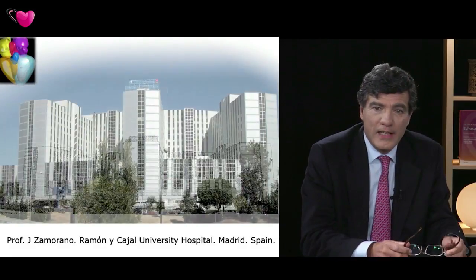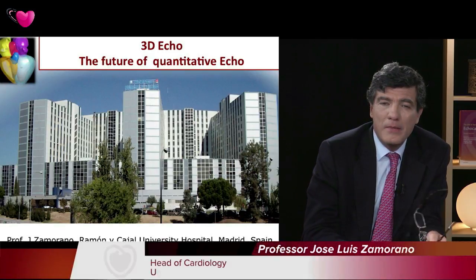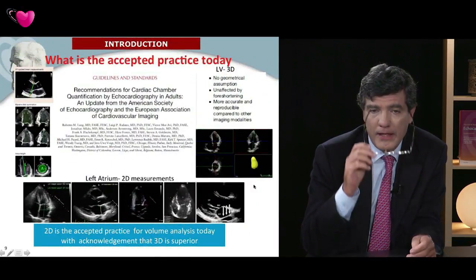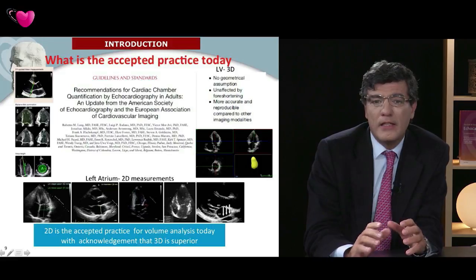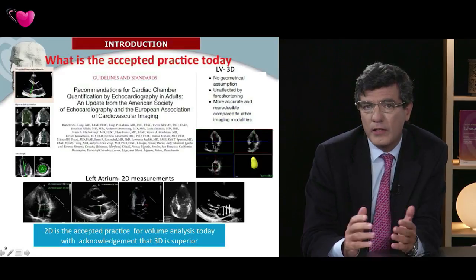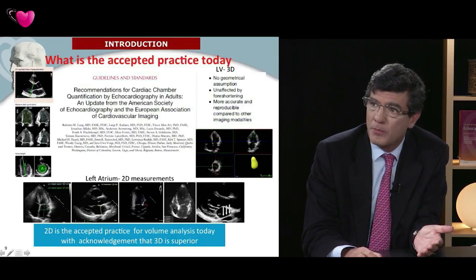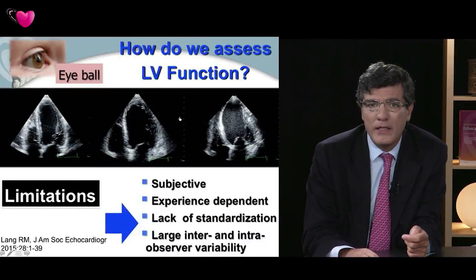Thank you, Stefan. I'm delighted to be with you all remotely. So now let me share with you what is happening today in quantification with echocardiography. I think there is no doubt that if we look at the guidelines, what is really accepted today is that 3D plays a clear, important role in quantification of systolic volume, diastolic volume, what happens in the chambers, and systolic function. In fact, we know that 2D is currently adopted in all labs, but it's not really the optimal way to assess LV function.